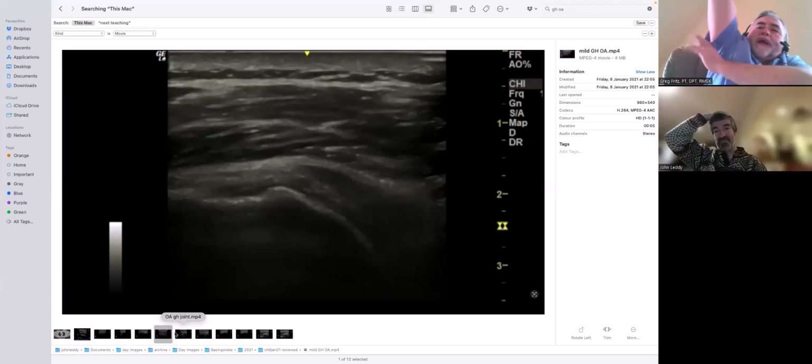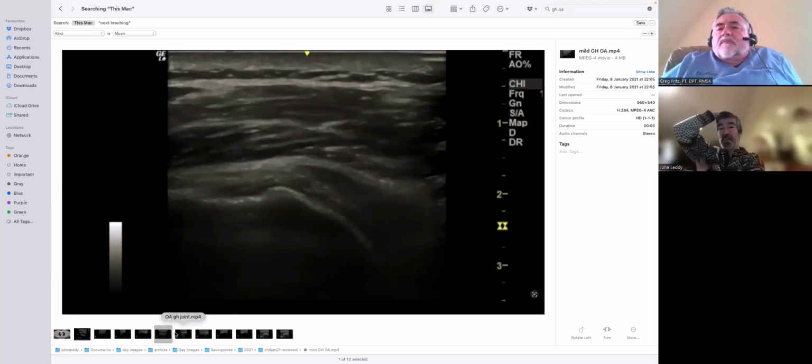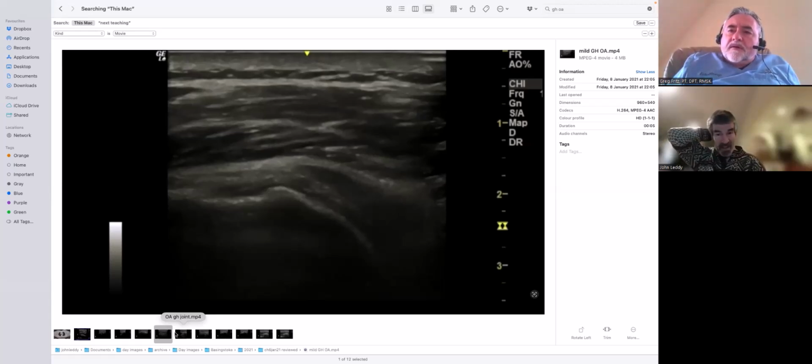Okay, so just right underneath here. Yep. I just line it up on the humerus and crack it on in there. Drop the depth down as far as 6 centimeters if necessary. You're not measuring capsule. You're just looking for big bony bulk. No, both. Okay. I don't measure the capsule. I don't find that. You just look at it and say that's big.